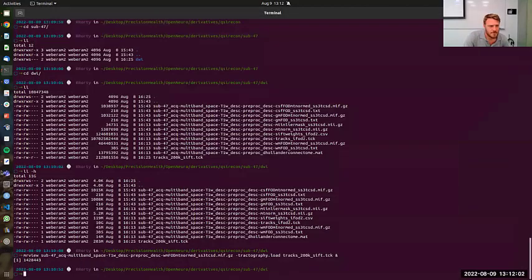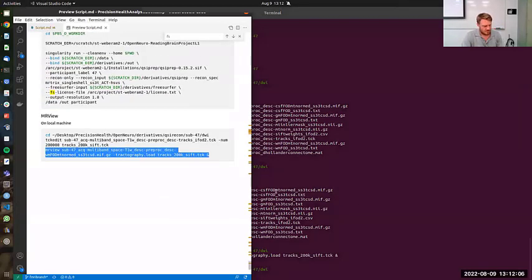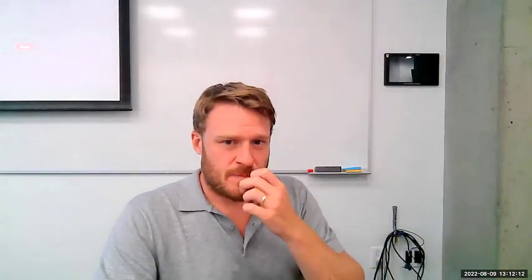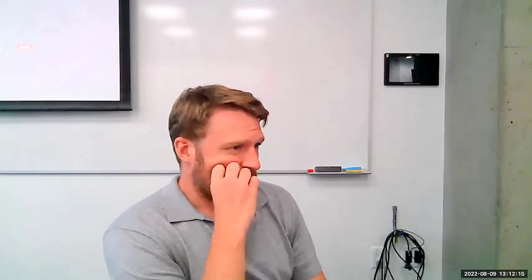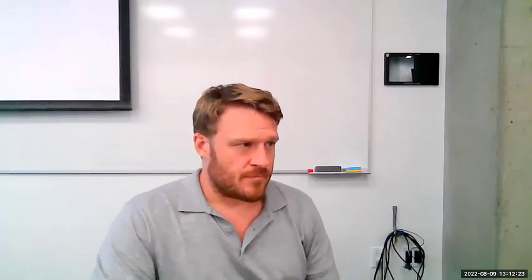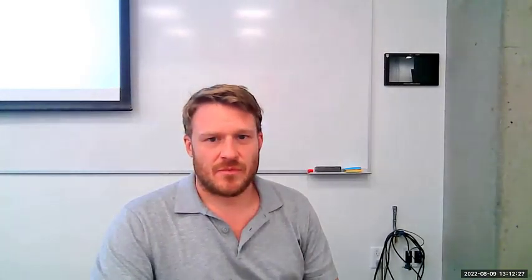But yeah. So this figure is amazing, and my point is that it's a little bit complicated, and it's really hard for the human eye to identify the difference. So is there any software, for example, to compare phase 1 and phase 2? What's the difference in the tractography? Yeah. So actually, MRtrix does this.